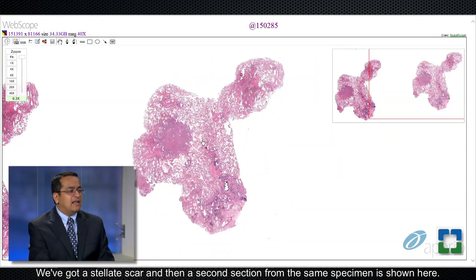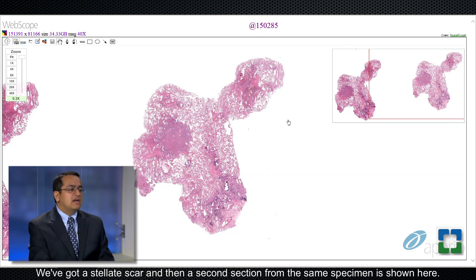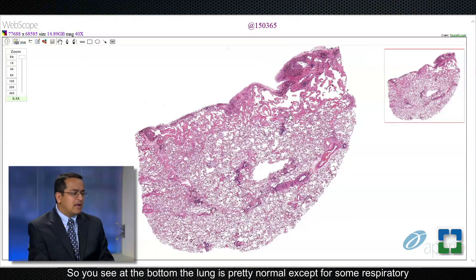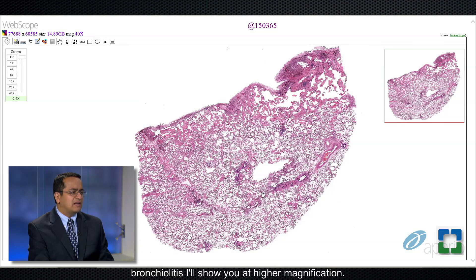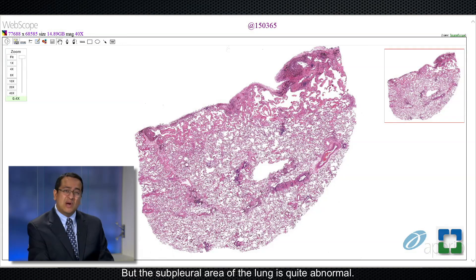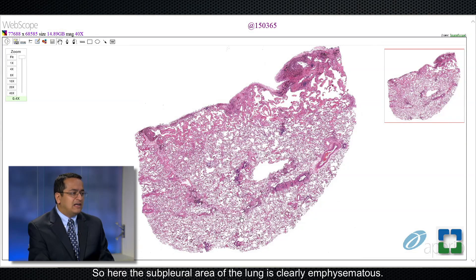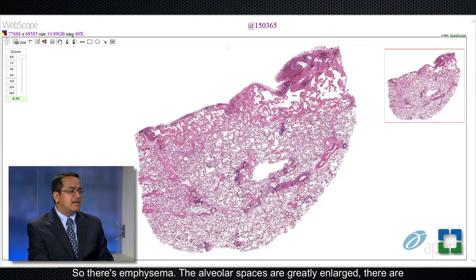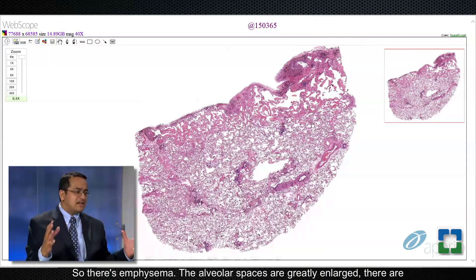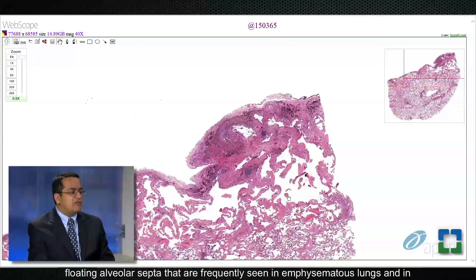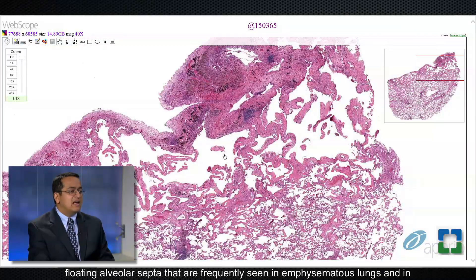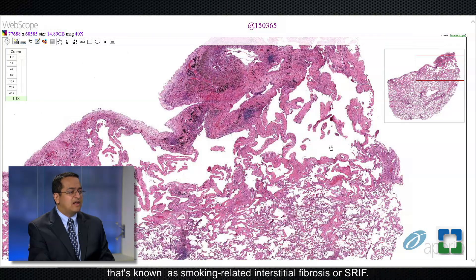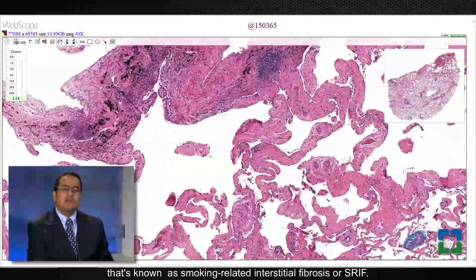A second section from the same specimen is shown here. The bottom of the lung is pretty normal except for some respiratory bronchiolitis I'll show you at higher magnification. But the subpleural area of the lung is quite abnormal — clearly emphysematous. The alveolar spaces are greatly enlarged with floating alveolar septa frequently seen in emphysematous lung. In addition to that, there is ropey hyalinized collagen within the alveolar septa, known as smoking-related interstitial fibrosis or SRIF.